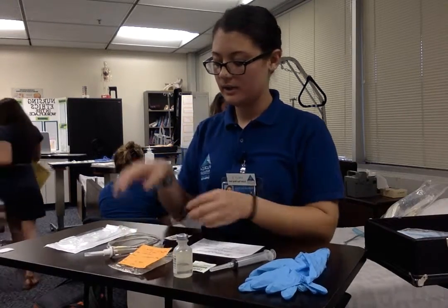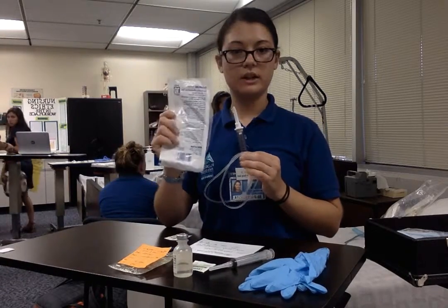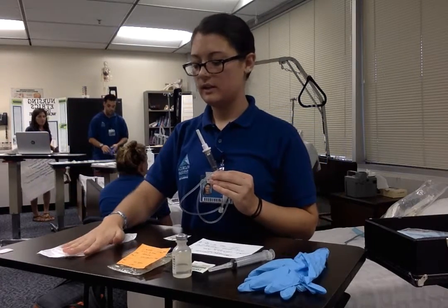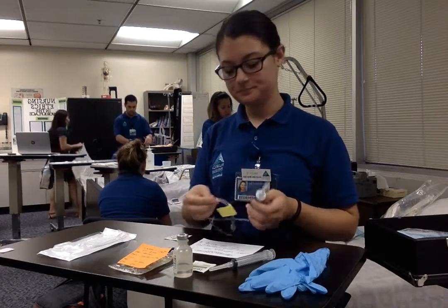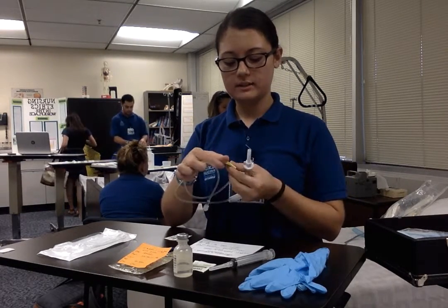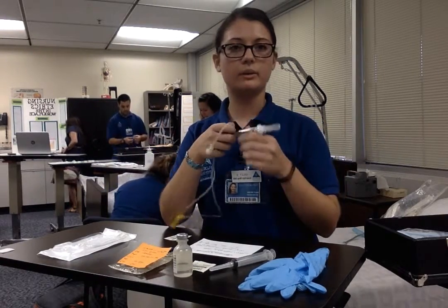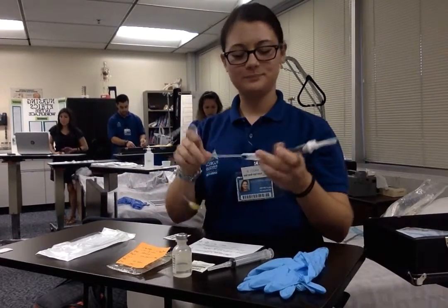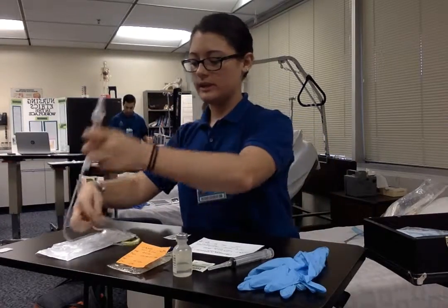And I also have my piggyback line, which my bag, we're going to make sure that it's all intact and everything, and it has a drop factor of 10. So that's going to make my calculations come out to be 17 drops in a minute. So before you get started, you want to go ahead and date and time and initial your line, because these will go bad in about, not an hour, 24 hours. So we're going to go ahead and write that down just so we know when the last time that was changed.